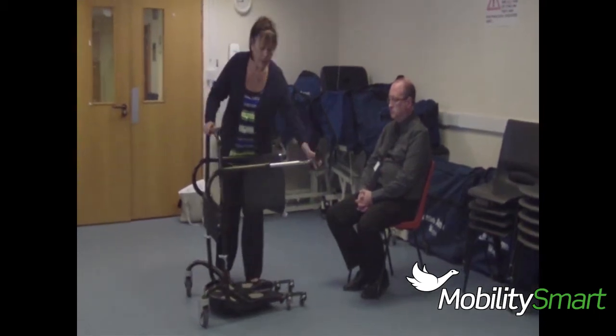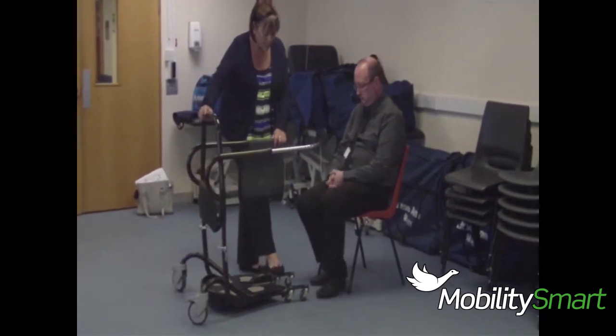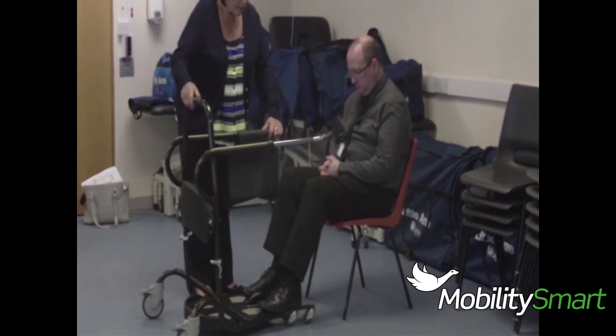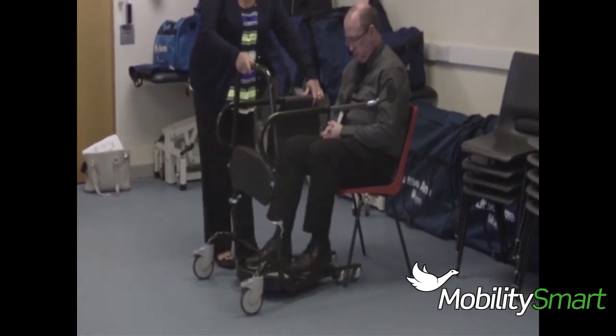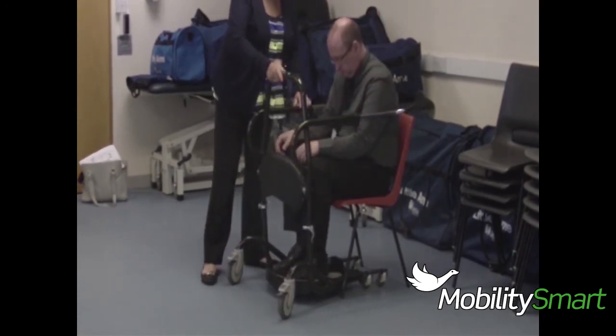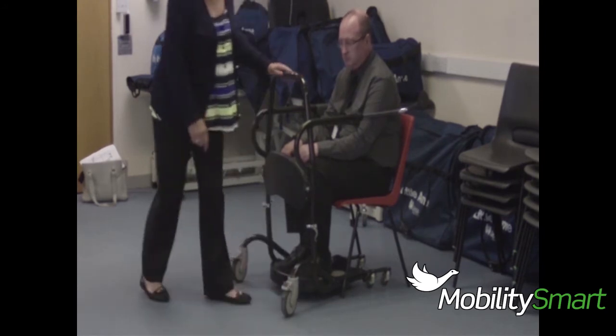We open this up like so. As we bring it into the client, we'll put one foot to here and the other side. And then as I push the unit in, you're going to walk your feet forwards for me. That's it. And we want your toes pretty much touching that front ring. That's lovely. Okay, then, very important, we put the brakes on.